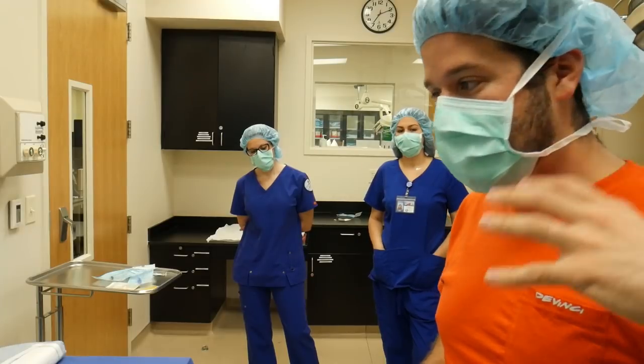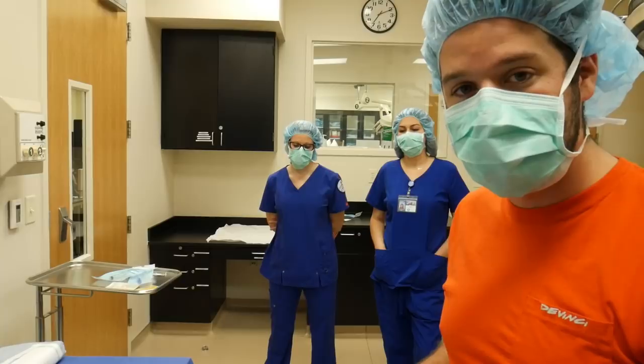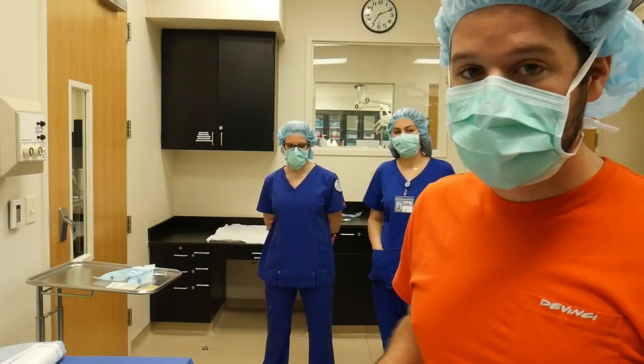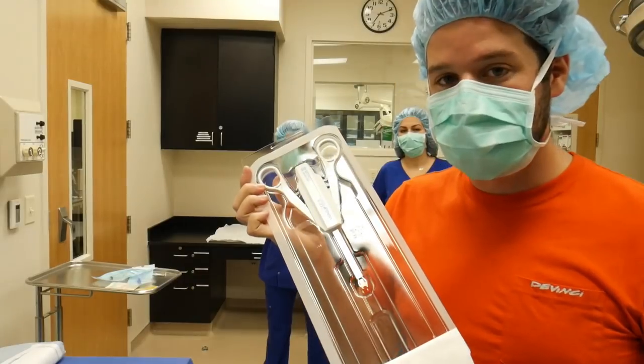Now we've kind of gone over peel packs and wrapped items that we can open up onto a sterile field, but I really wanted to touch on items that are difficult to open up onto a sterile field — one being something like this, which is a clip-a-plier.